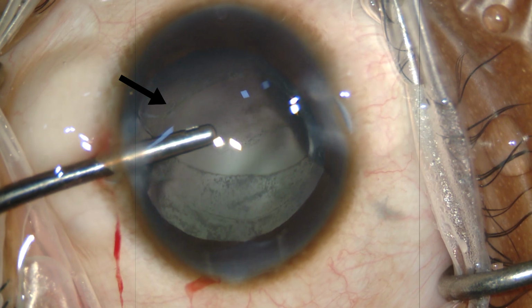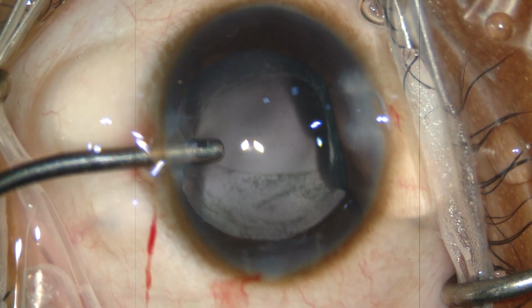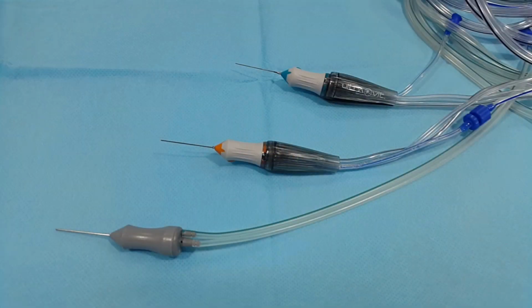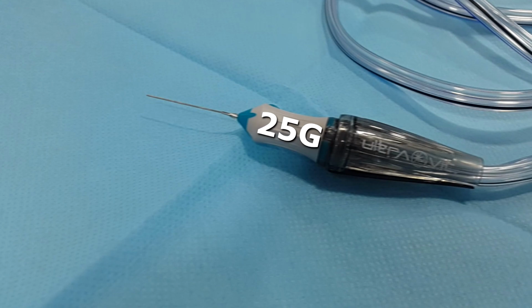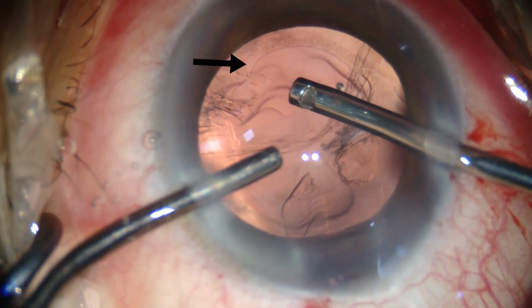Once you have a PC tear with vitreous loss, there are 4 important things we have to remember. Number 1, vitrectomy cutters, 20 gauge, 23 gauge or 25 gauge. Number 2, bimanual vitrectomy.